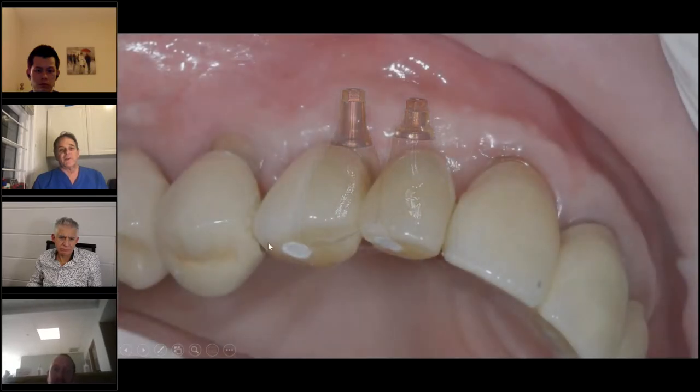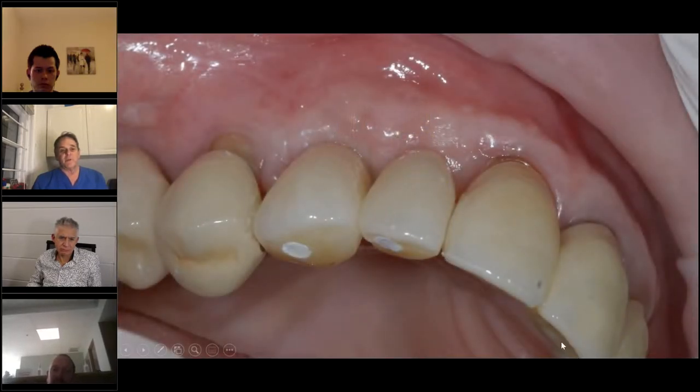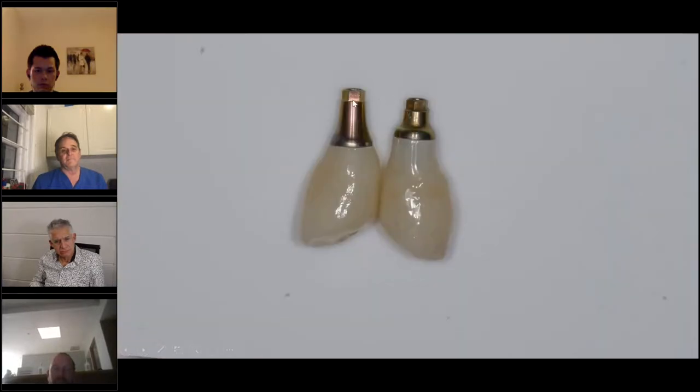Thanks, Ludwig. Yeah, that's an interesting one. I mean, with the abutments, one was a titanium abutment, and the other is more a stock abutment. These are actually stock abutments, called Easy Post, and you can see it's a little bit gold plated, and you can check that your technician doesn't grind on this very fine area. If it's a little bit polished in this area, it's okay.